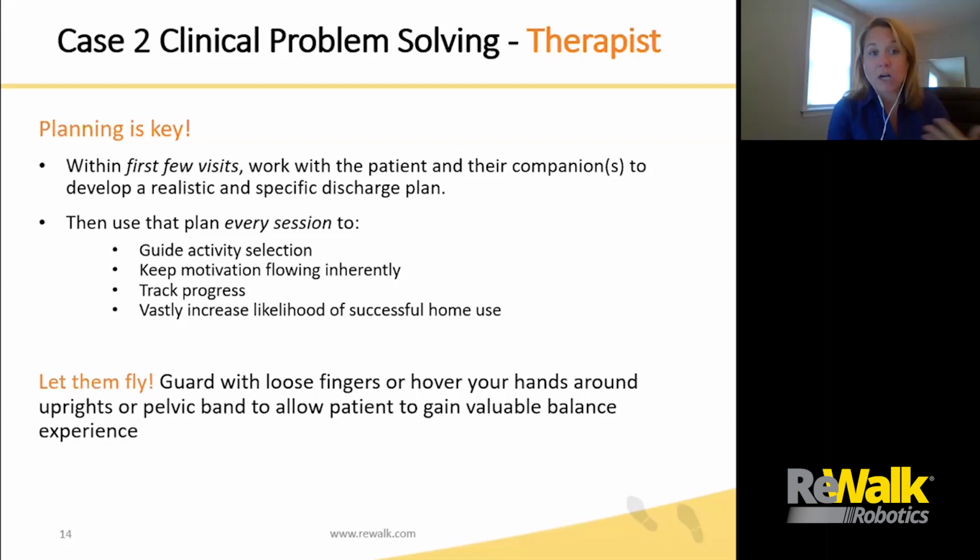So if you've been working on their standing balance with their crutching, you've got to start guarding them with loose fingers or even letting your hands hover lightly over the uprights or the pelvic band to allow the patient to gain some valuable balance experience.